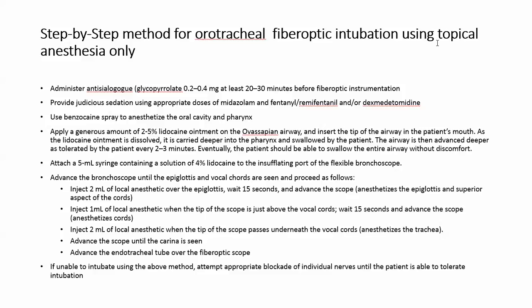The endotracheal tube is advanced over the fiber optic bronchoscope, the position of the endotracheal tube is confirmed, and the endotracheal tube is secured. Capnography is used to confirm the return of end-tidal CO2.